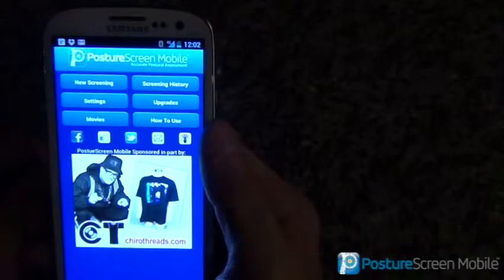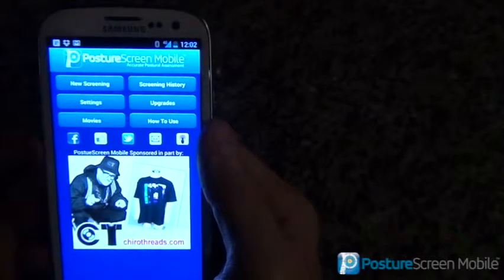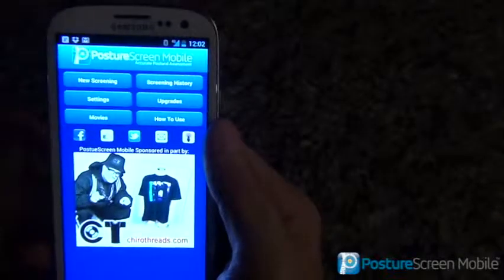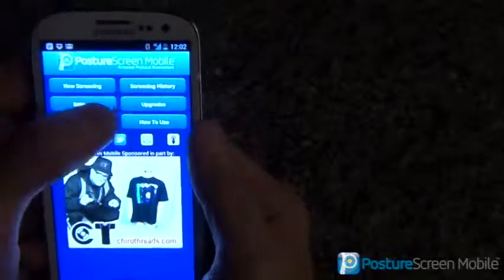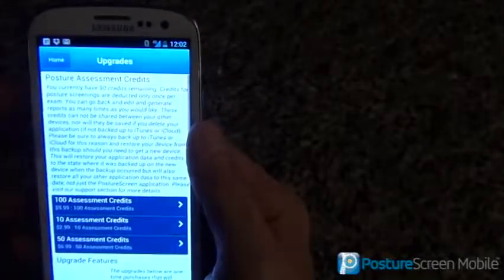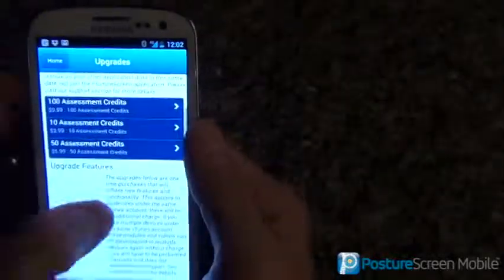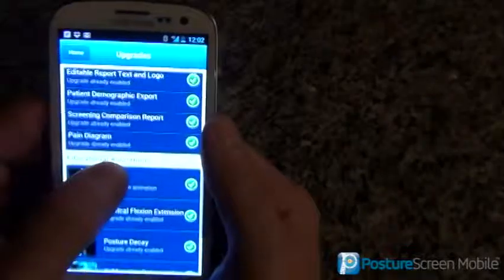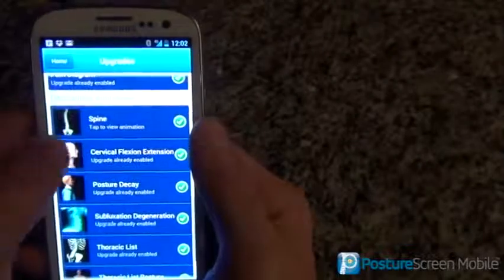Welcome back. To use the comparison module, it's quite simple. First, you must buy it under the upgrades. And if we go into upgrades, you can see that I've purchased everything already.